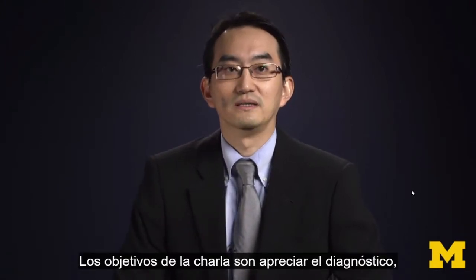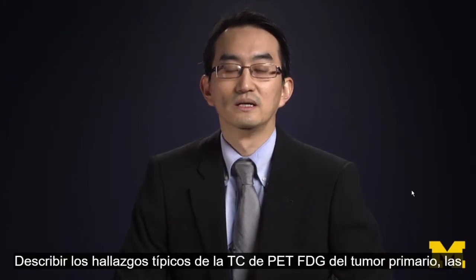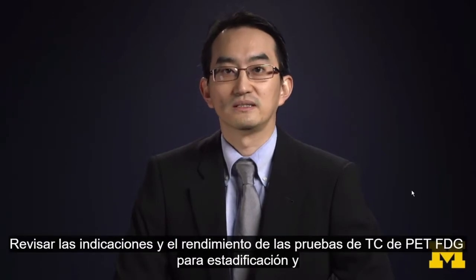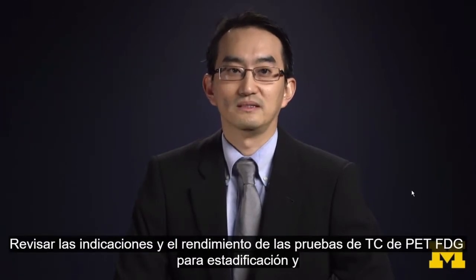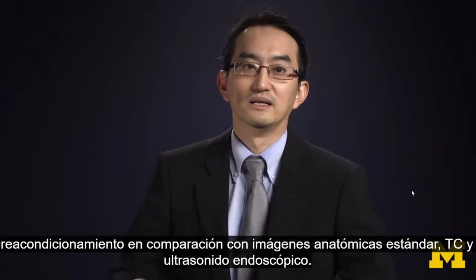The objectives of the talk are to appreciate the diagnosis, staging, workup and management of esophageal cancer, to describe typical FDG PET-CT findings of the primary tumor, regional and distant metastases, and to review indications and test performance of FDG PET-CT for staging and restaging compared to standard anatomic imaging, CT, and endoscopic ultrasound.